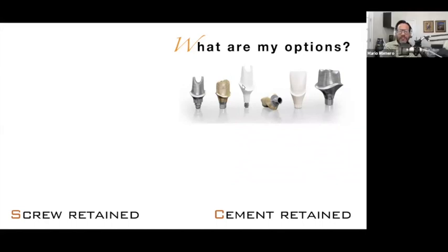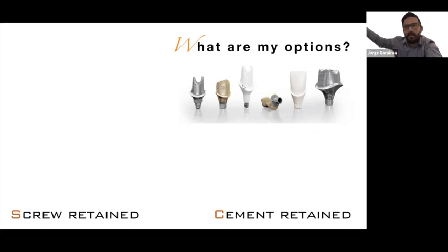Okay, so yeah, you're right. You can see gray scratches around the abutment. You're right, exactly. You can see gray scratches around the abutment. So how's that gonna translate in a long-term use of the restoration?